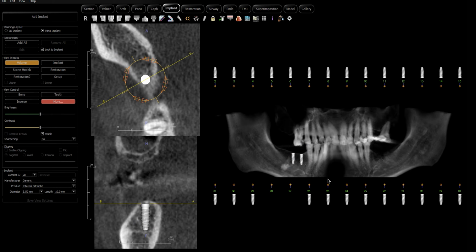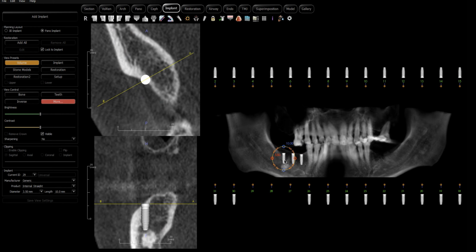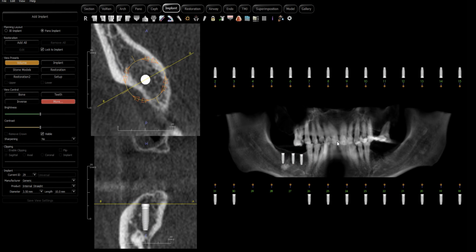Why is that relevant now? Because it dictates how you're going to build the structure on which the new teeth are going to be supported. If there's an environment, that environment is likely to continue. The stormy weather in this guy's mouth, i.e. parafunction, is likely to continue. As a result, I would maybe consider adding an additional implant here. You and I can spend more time talking about that, but the topic of this video is more about what we're doing in the planning processes with implants.